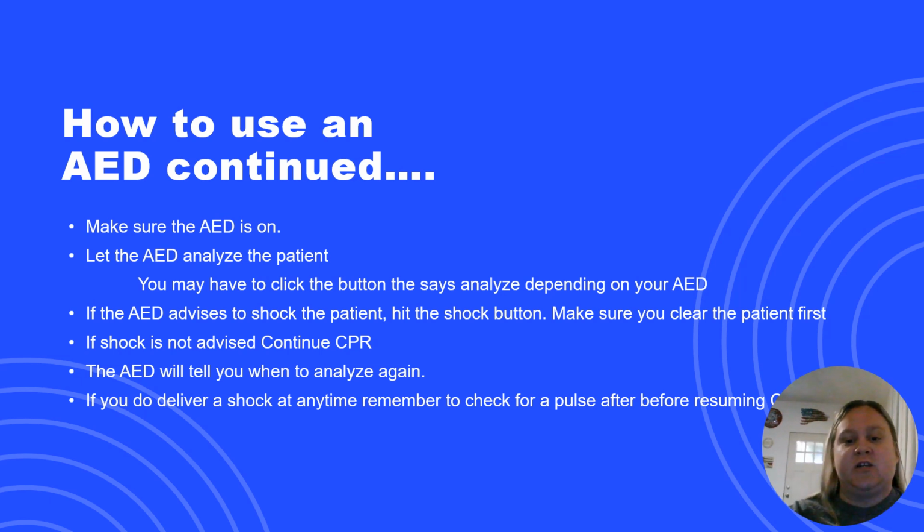But before you hit that shock button, we want to yell clear, and you want to yell it loud, and you want to yell it so that everybody can hear you, because you don't want anyone touching that patient when you deliver that shock, or you're going to have two patients. So you're going to yell loud and clear the word clear, and then everybody should understand and know that that means hands off the patient, okay? All right, so if the shock is not advised, you're going to continue chest compressions, okay?